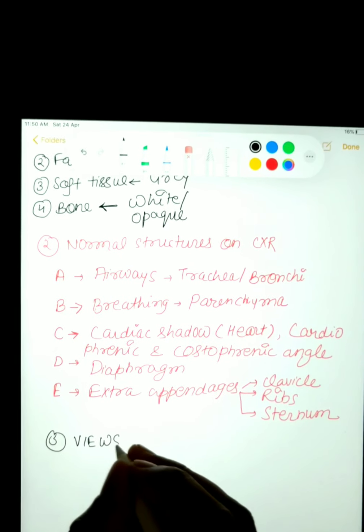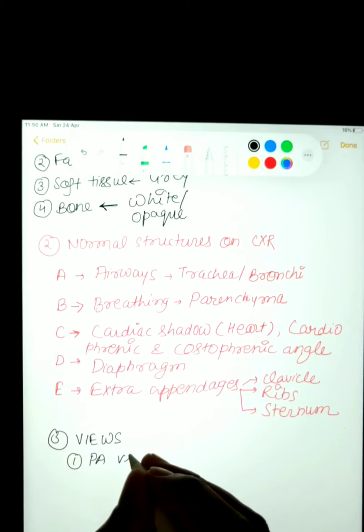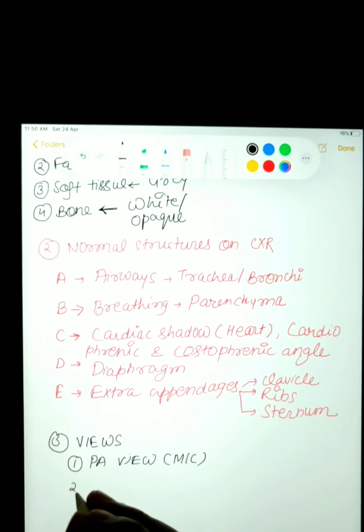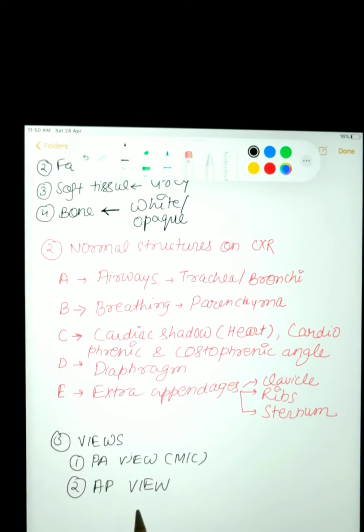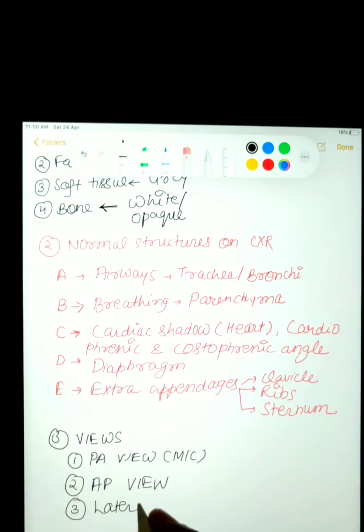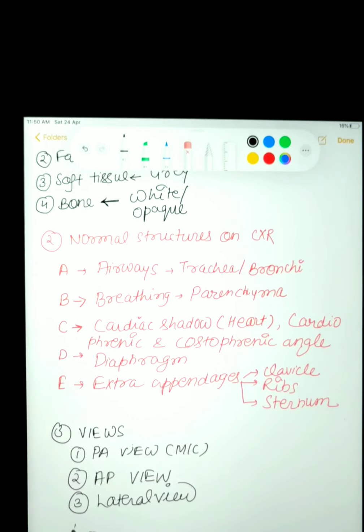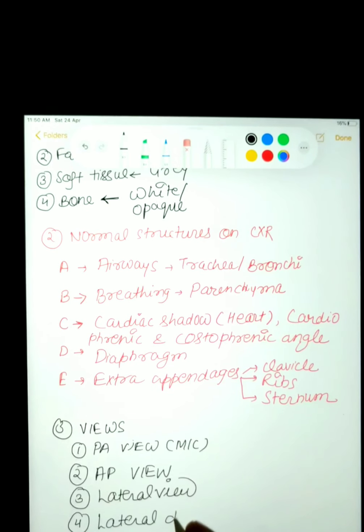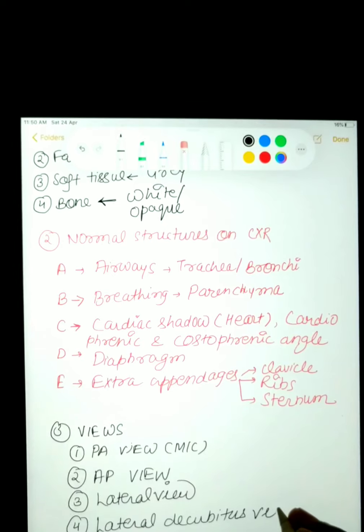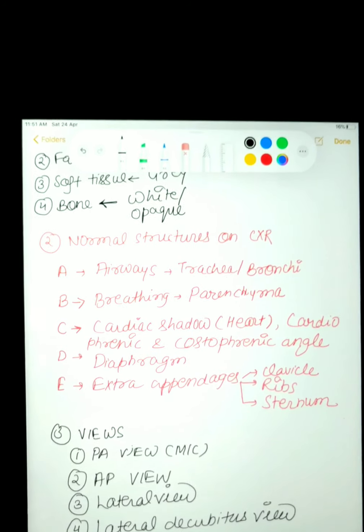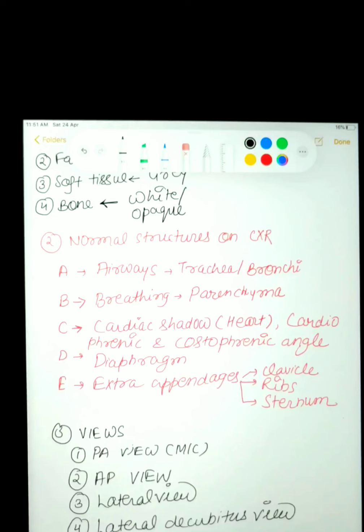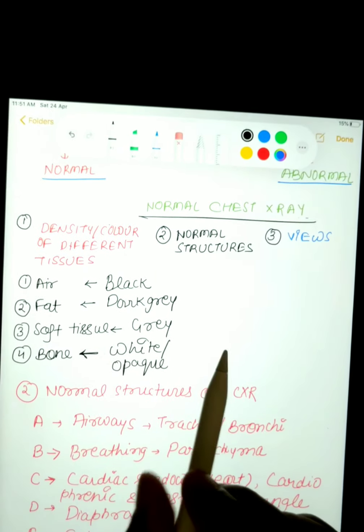Now we will learn the different views of chest X-ray. We have the PA view, which is most commonly done. PA stands for posterior-anterior view. Second is the AP, or anterior-posterior view. Third is the lateral view, fourth is the lateral decubitus view, fifth is the oblique view, and lastly the lordotic view.